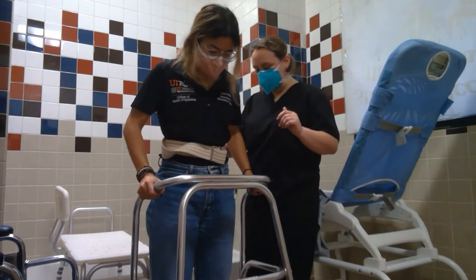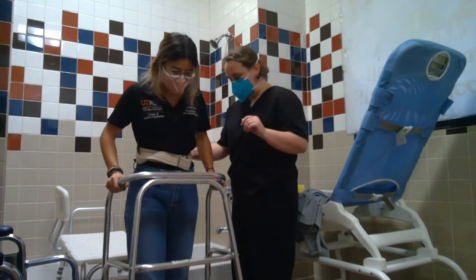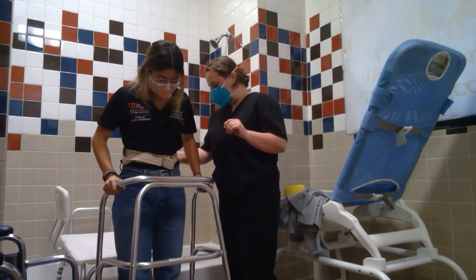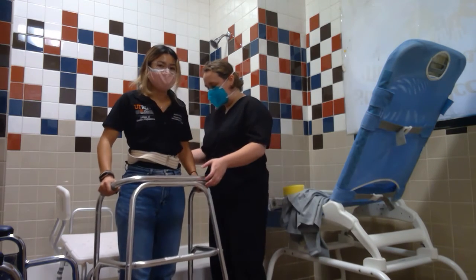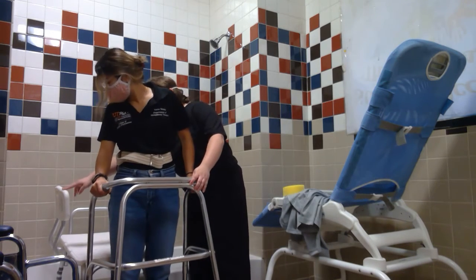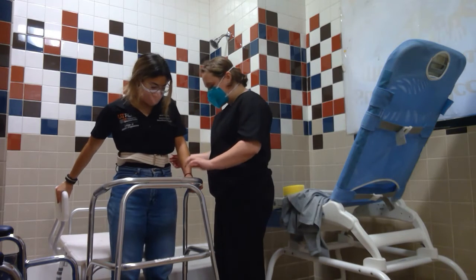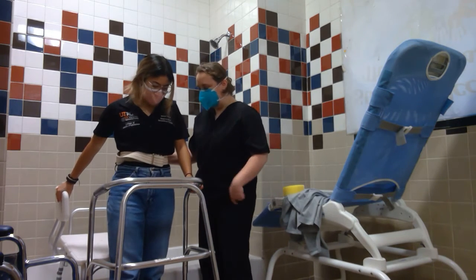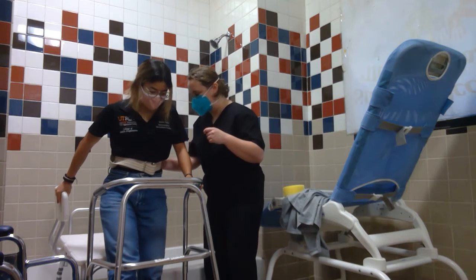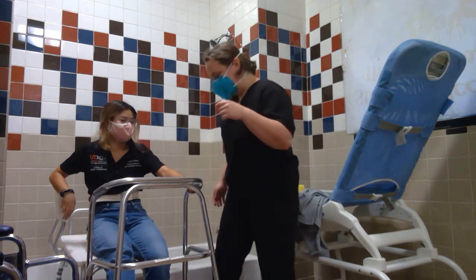Okay. And with your strong leg. Oh, I feel it. You feel it? All right, and so now what you're going to do is with this arm, you're going to reach back and grab the tub chair and hold on to the walker, and you're going to just lower yourself, don't bend that leg, and I'll be right here to help you guide down. Great, feel good? All right.